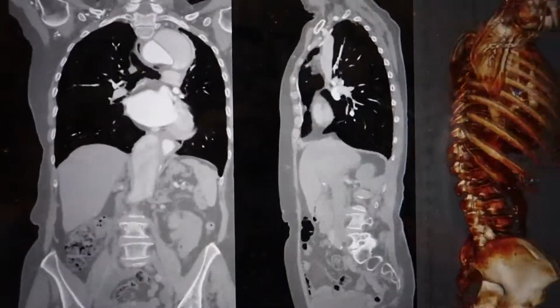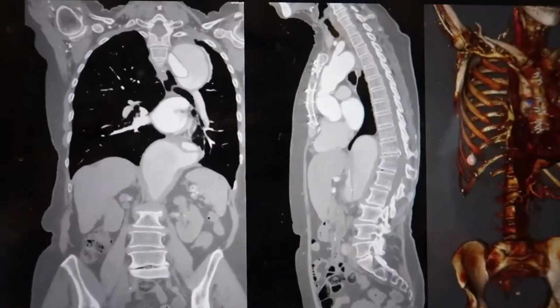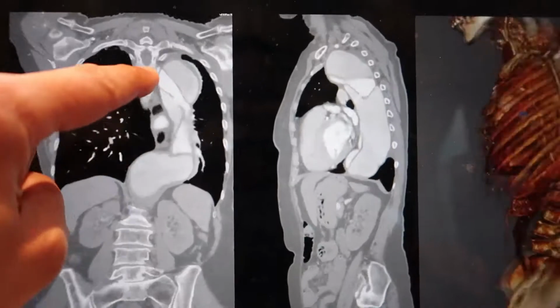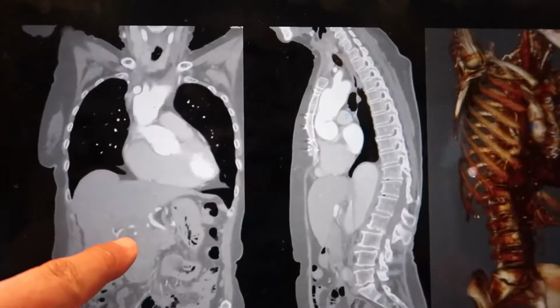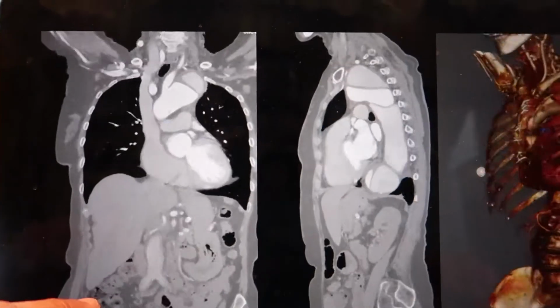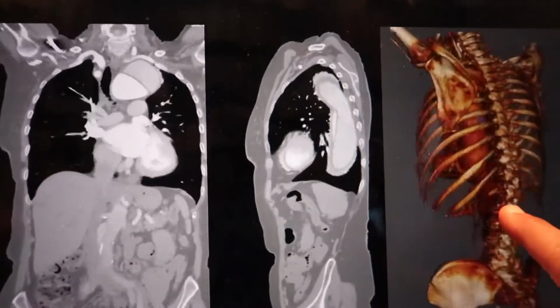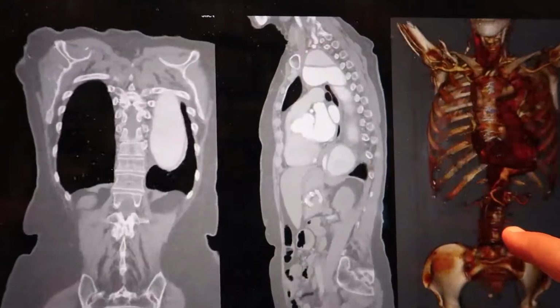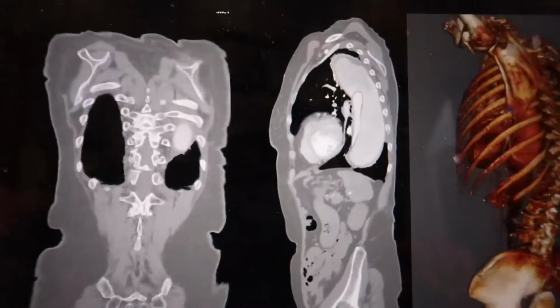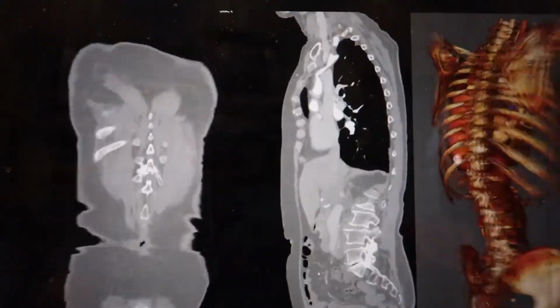So this is a 62-year-old lady who came to us with acute type B complicated aortic dissection. You could see here the problem starting in here with a huge aneurysm and the false lumen compressing the true lumen. The problem that she has is the left kidney coming from the false lumen, and there's no perfusion at all in her legs, rest pain, cannot walk, and severe interscapular pain. We kept her in for 82 hours in the ICU, tried to control the pain and to drop her blood pressure, but to no avail.